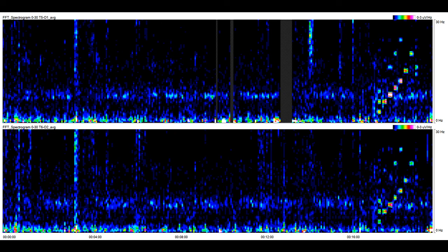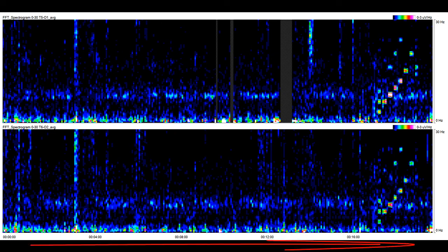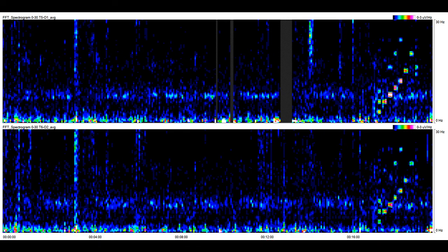Before returning to the original clinical example presented at the start of the session, let's consider one more important aspect of the anatomy of an FFT spectrogram: scaling. There are three primary scale parameters of importance, those for the x, y, and z axes. I just touched on the x-axis time scale. Like the EEG time axis, the spectrogram's time base can be adjusted as needed to show a longer or shorter period of time.